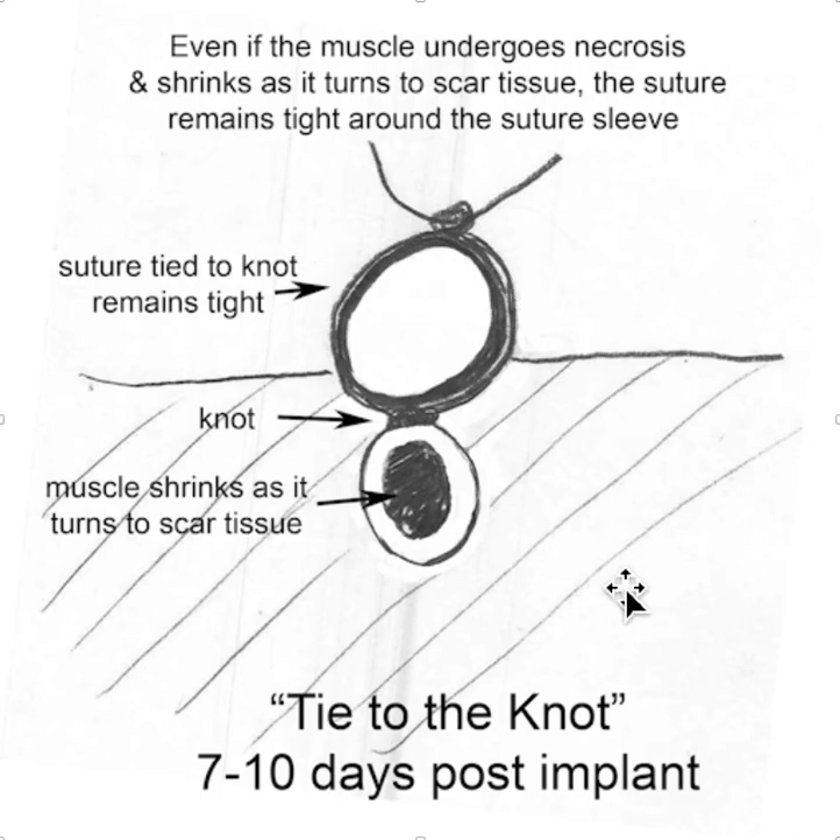And it's not going to pull loose. This may move a couple of millimeters back and forth, but it remains tight here. I know a lot of places are trained to tie directly to the muscle, but if you do that, this will eventually happen to you, and the way to prevent it is to tie to the knot. Thank you for your interest.